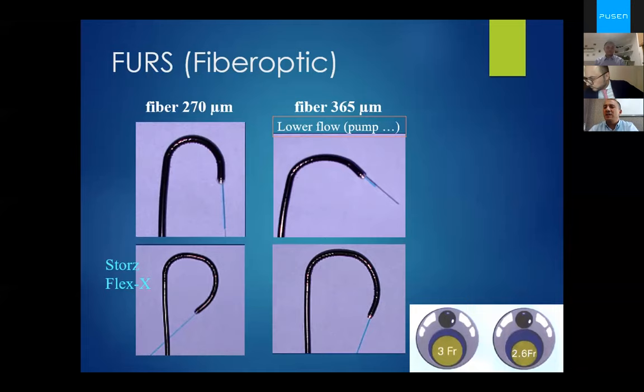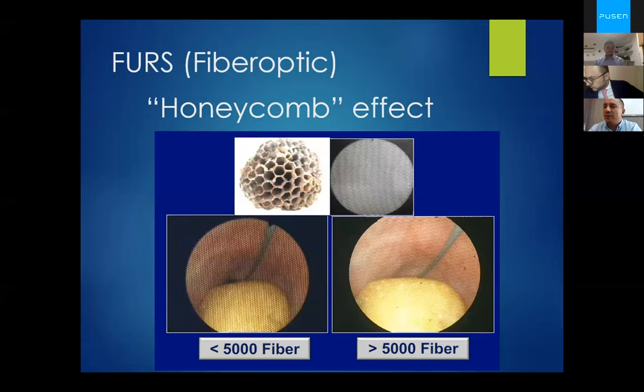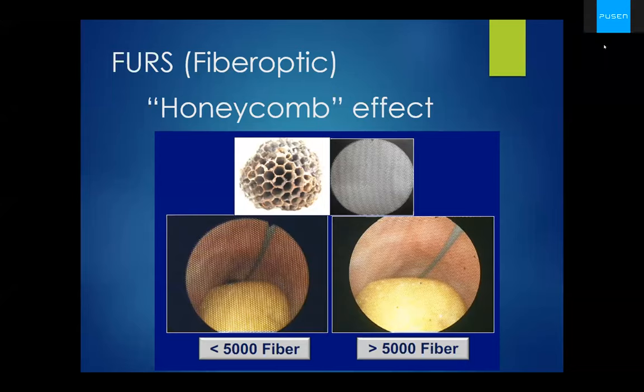As you see here, the optical qualities of those scopes vary from one manufacturer to another and depend on the number and quality of the optical fibers used for image transmission. Depending on the number of optical fibers used, a honeycomb image effect will be displayed on the monitor. The use of smaller optical fibers, more than 5,000 fibers, improves the honeycomb effect, but increases the fragility of those optical fibers.